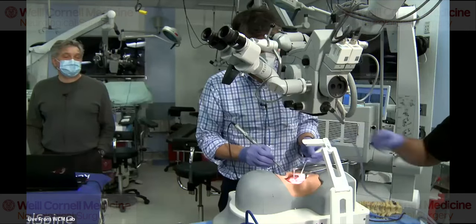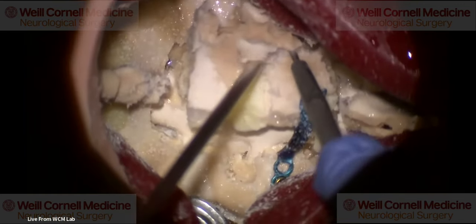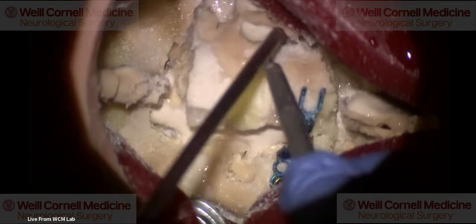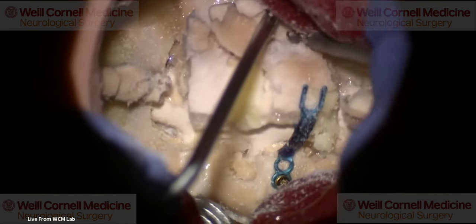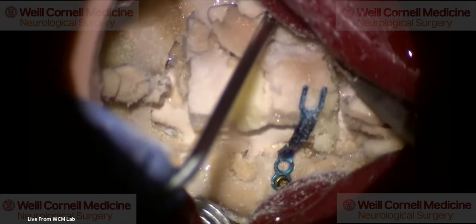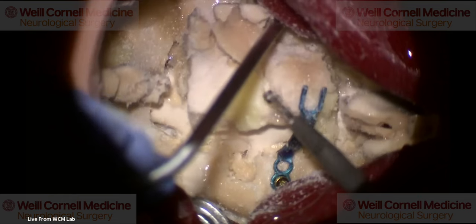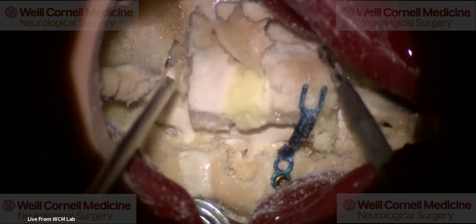We're smoking here. So by removing that spinous process like that, we got a nice trapezoidal shaped dorsal spine, and that's a much better presentation to the muscles here. It's much more even. It's flat here. It's coming down this way and coming down that way. The muscles will then sit on top of this, and so it'll be lifted off, and it'll be able to grab this and do an extension.